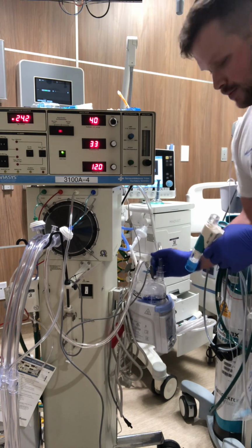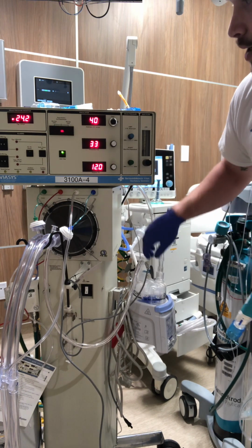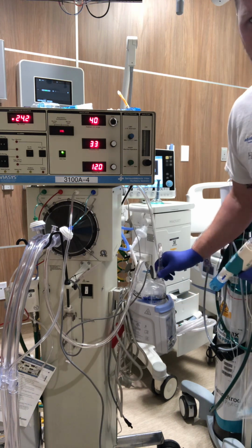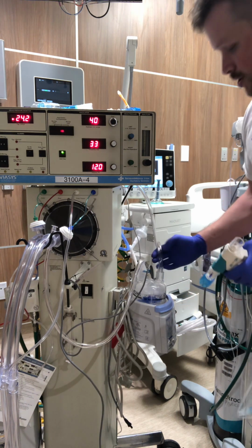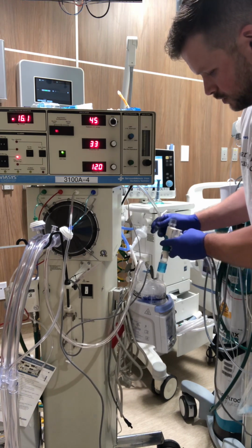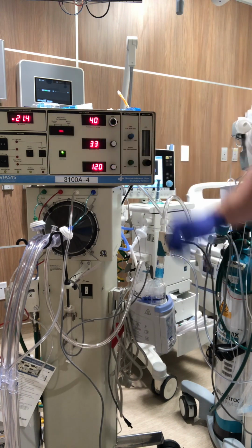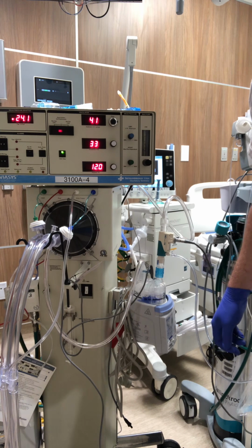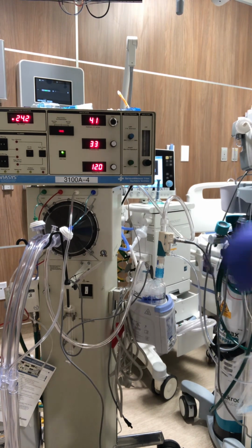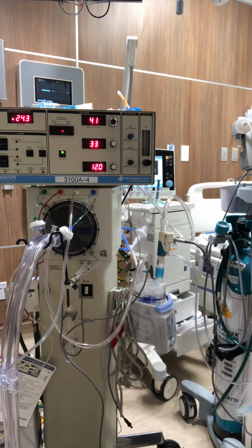I'm going to add this now. I expect this to alarm and I expect it to shut off, so I know that I'm ready to repressurize your system and get it back on as quick as possible to minimize interruption to the patient. So adding your module. Hold down reset/power fail for about 2 seconds and it will repressurize and turn back on automatically, like it did. So that was probably a maximum interruption time of about 2 seconds to your patient.